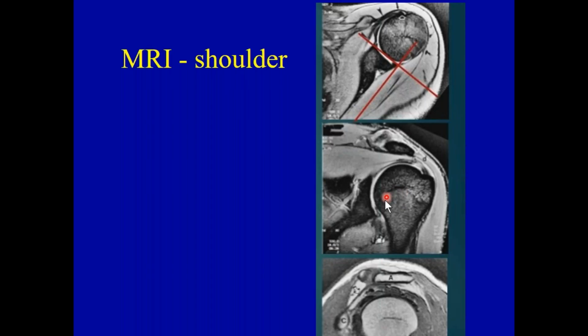This is still the humeral head. This is the scapula. This is the acromion process. And the clavicle would be where the laser pointer is now. But the beauty of the MRI is I can see where the laser pointer is now. That is subcutaneous tissue, including fat. This is the deltoid muscle, the big muscle around your shoulder. And now we can see the supraspinatus muscle.